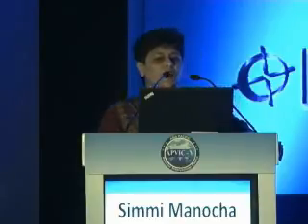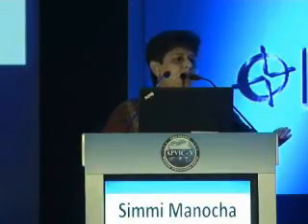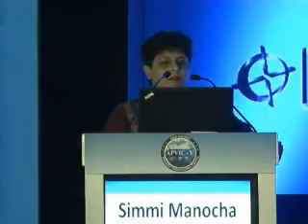So the buttons are there on the machine. You can use all kinds of Doppler system for doing the peripheral work. There are buttons for depth control, which can change the field of view for the structure being imaged. You can go depth up or depth down, depending upon the area of interest. Depth controls how much distance into the body the image displays into the far field.